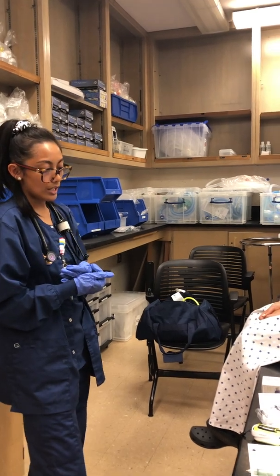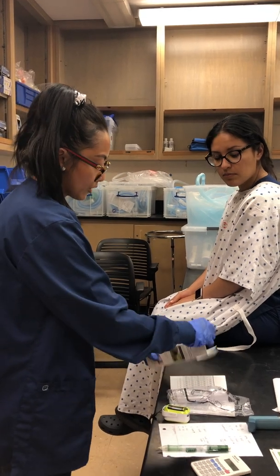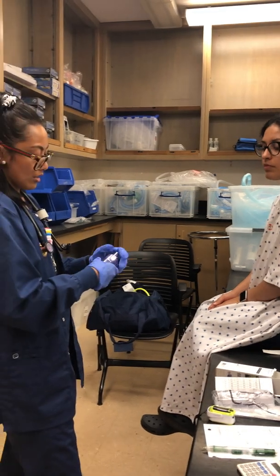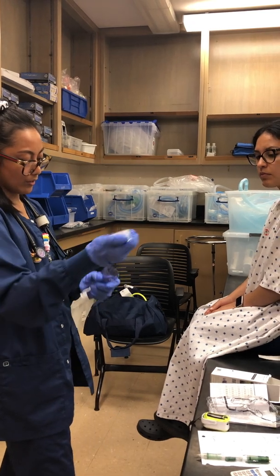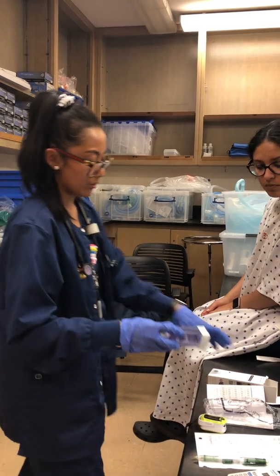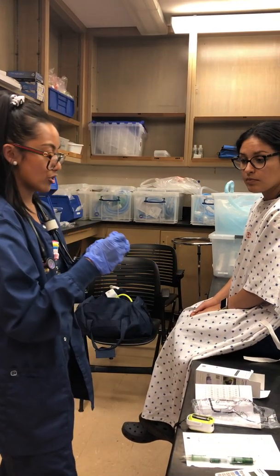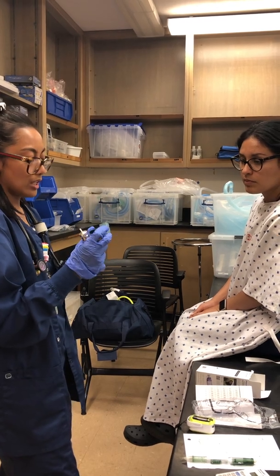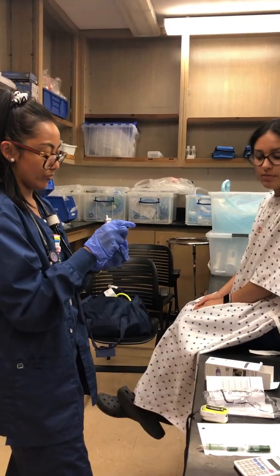Okay. And then also for the care for the meter dose inhaler and your chamber, you could take the parts apart and you could wash them and soak them in warm soapy water. You could always take everything apart, take this part off, take this part off as well. Soak them in warm soapy water and let it air dry. Same thing for this. You wouldn't wash your canister. You would just wash the actuator and the cap. And also, if you're going to be keeping this in your purse, just make sure that this is clear of any dust so that you don't inhale it.